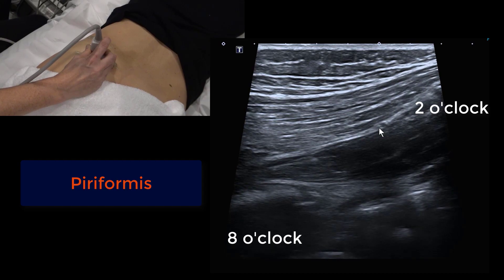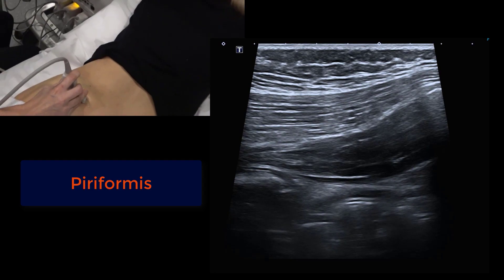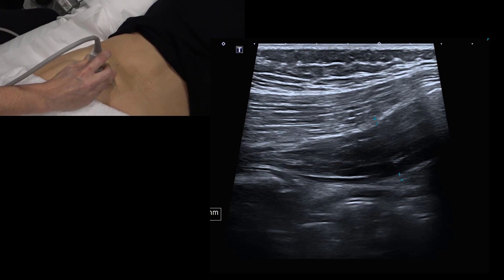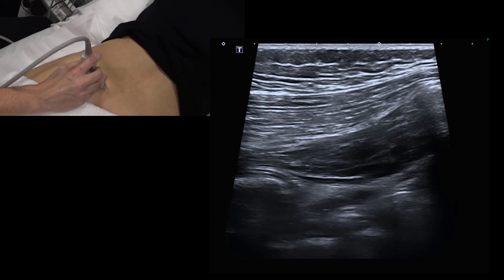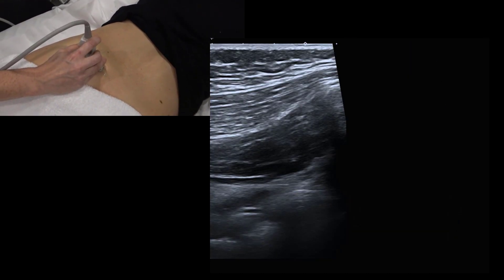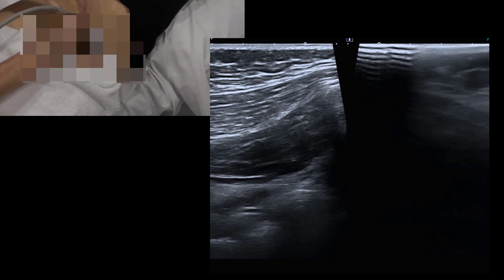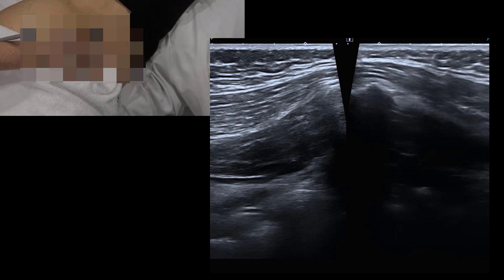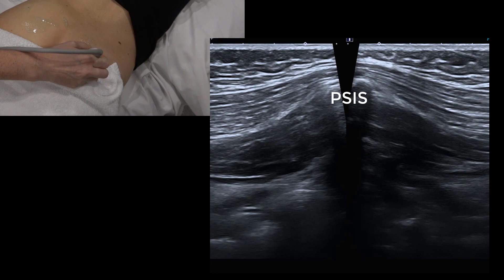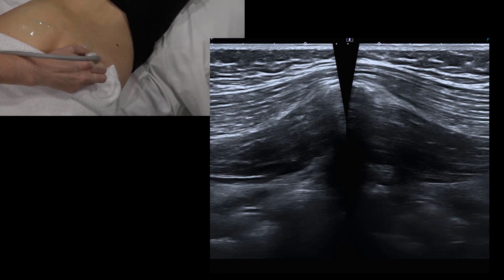We can find an area here to measure muscle depth and look at the echogenicity. That gives us a good image to use as a comparison with the other buttock. For a comparison view, instead of 2 o'clock to 8 o'clock, we go more like 4 o'clock to 11 o'clock, and you can put the muscles side by side.